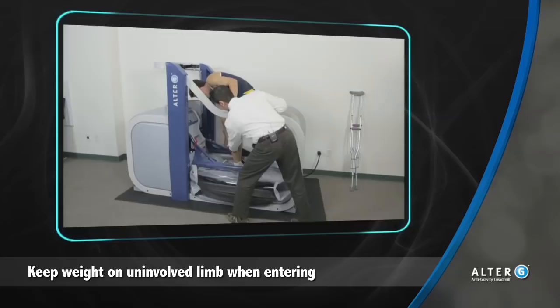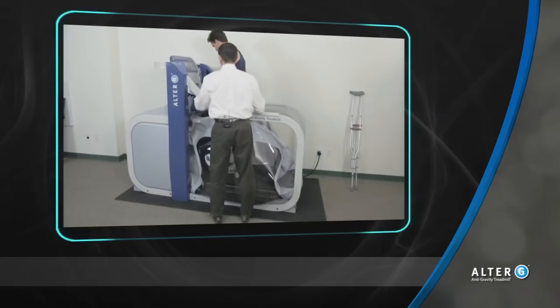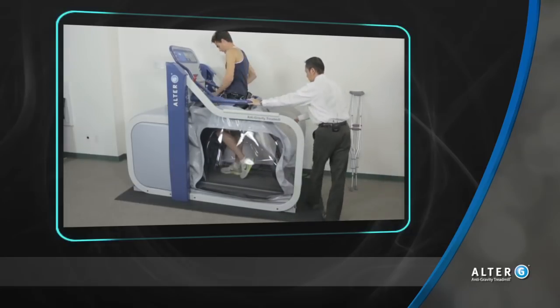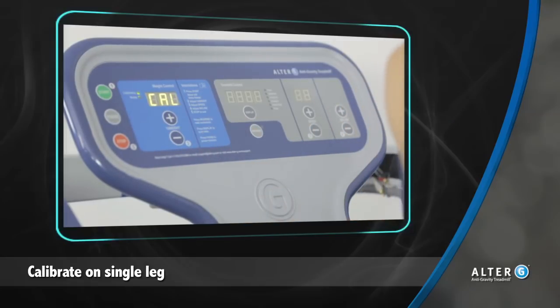For a patient that has weight-bearing restrictions, assist them into the Alter-G with weight only on the uninvolved side. Because of the Alter-G's patented calibration system, it doesn't matter how large the patient's base of support is — the Alter-G will still be able to sense the user's body weight and calibrate appropriately.